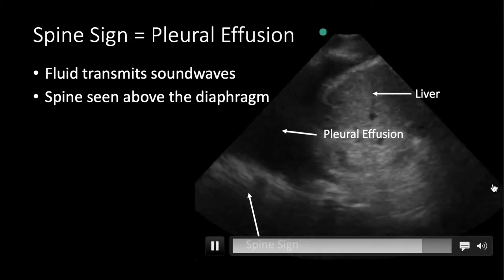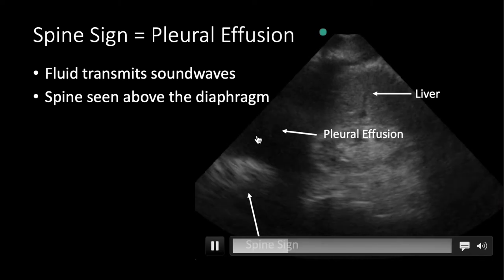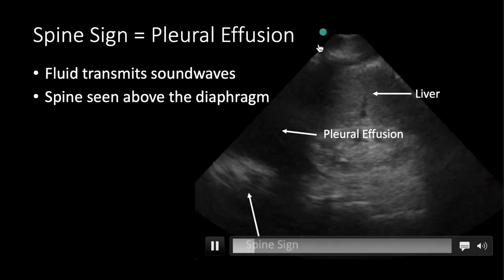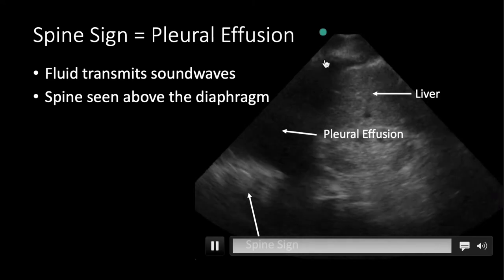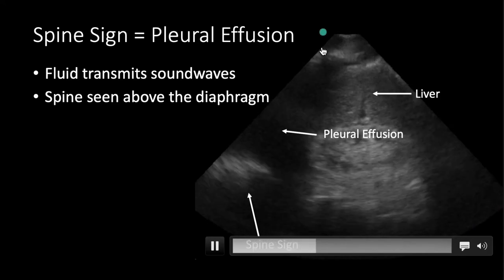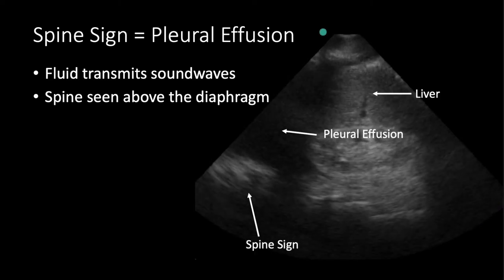Now let's compare to this case. We've identified our liver, diaphragm, and spine. Again the lung here is anechoic, but we see the spine continue above the diaphragm. We must have some fluid here that's transmitting sound waves better than air — those waves hit the spine and travel back through the liquid to the probe. This is known as the spine sign and is indicative of a pleural effusion.